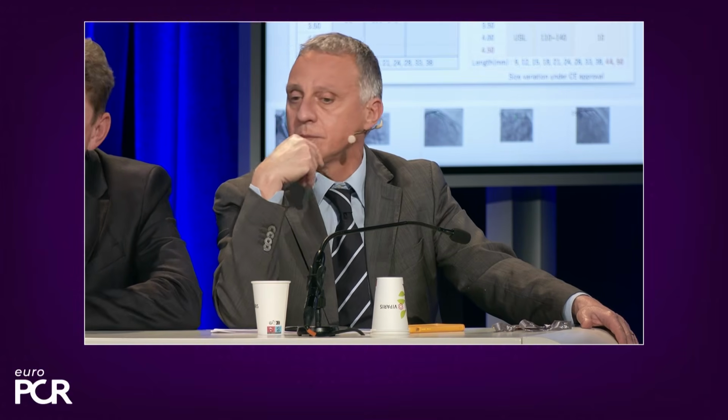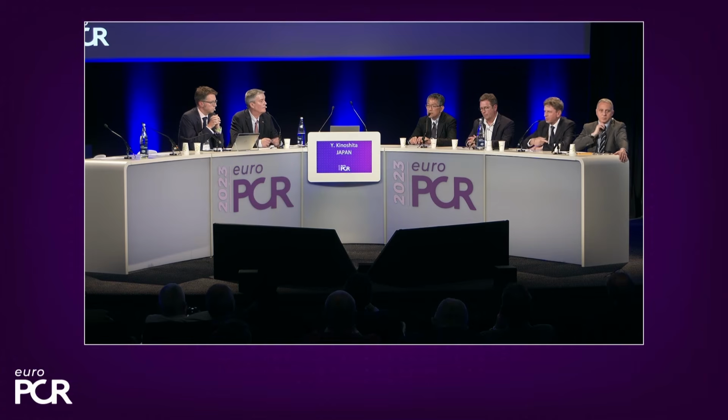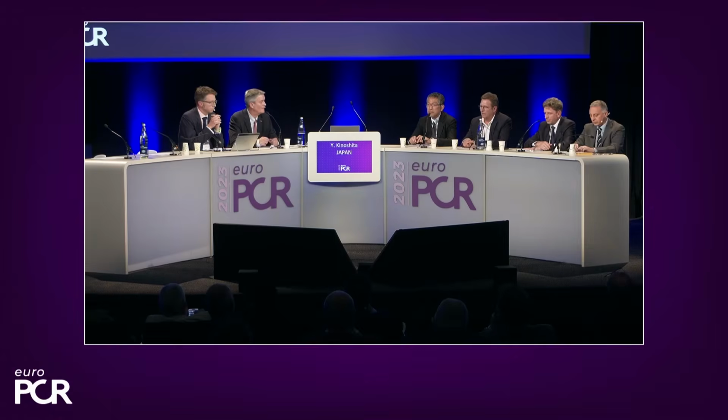This seems, according to our practice, to increase the safety of ending at the ostium. Final words, Maciej? Just this case was a beautiful demonstration how to avoid this dilemma, because if you do imaging and you see there is no significant disease at the ostium, you don't have to cover the ostium, and there is no such a dilemma. Final comments? Final comment is that we also remember that there is elastic tissue in the ostium of the left main, which means the recoil potential is bigger in that area. So that is a concern when we are placing stents in that area.